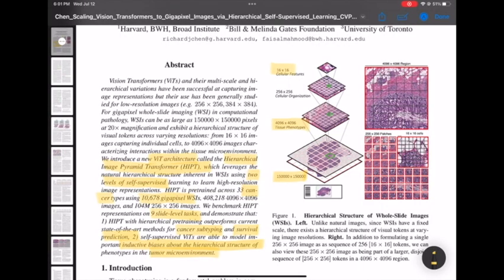This example is an image of a tissue slide taken from a surgically resected tumor. The patient undergoes surgical treatment, and the excised tumor tissue is then fresh frozen or formalin fixed, paraffin embedded, and later, the slides are stained with hematoxylin and eosin and viewed at a fixed magnification level, usually 20x or 40x, depending on the institution and the scanner.